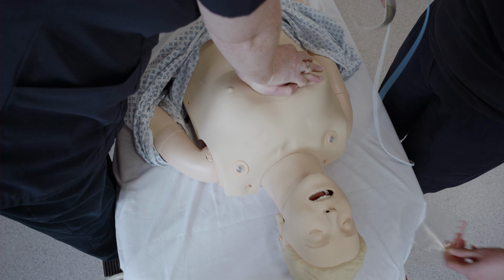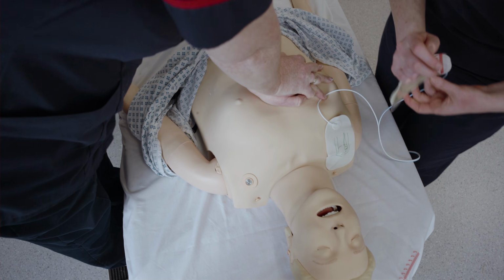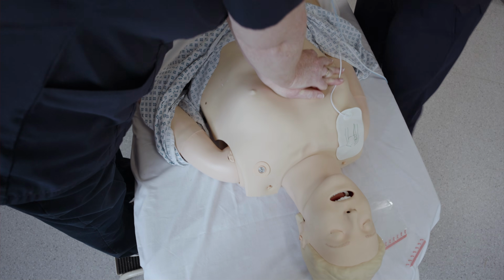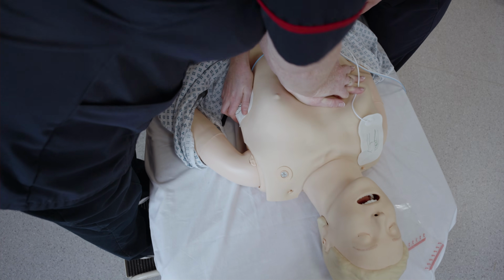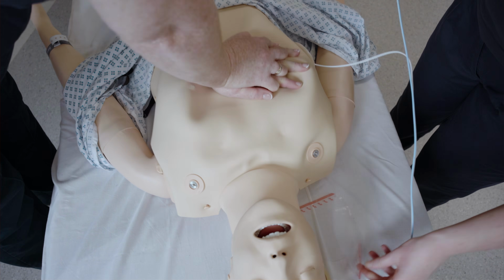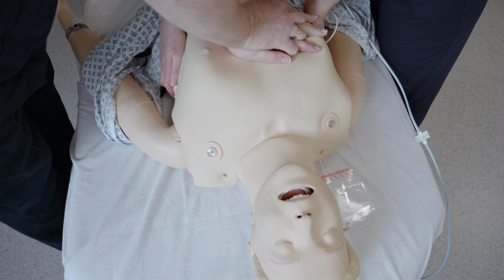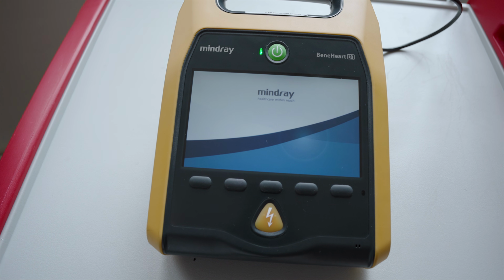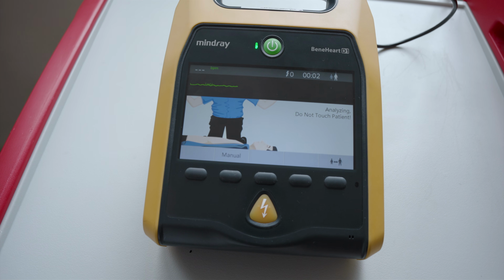These can go in the mid-clavicular line on the right shoulder and the mid-axillary line of the left chest wall. These can also go biaxillary or anterior and posterior positioning. CPR is ongoing at all times. Turn the defibrillator on by the green light button. This is an AED. Adult mode.